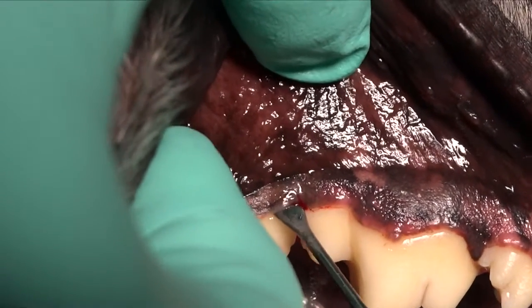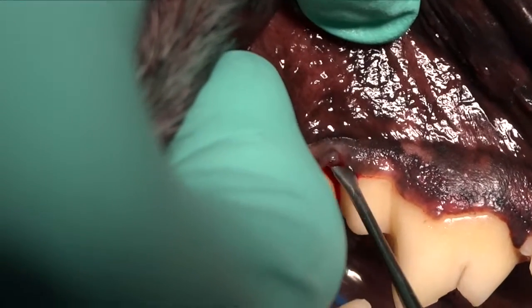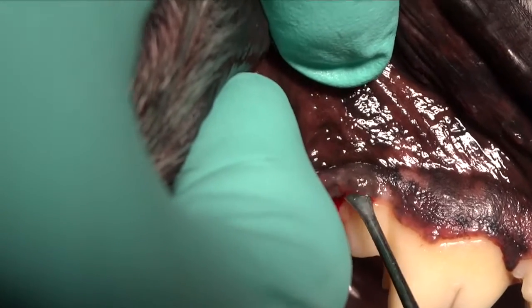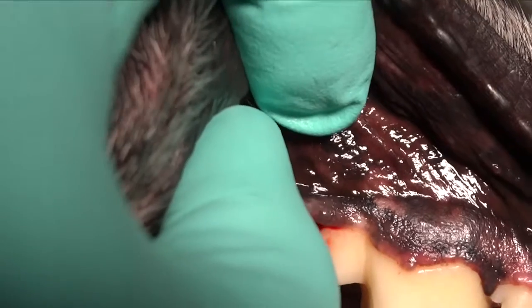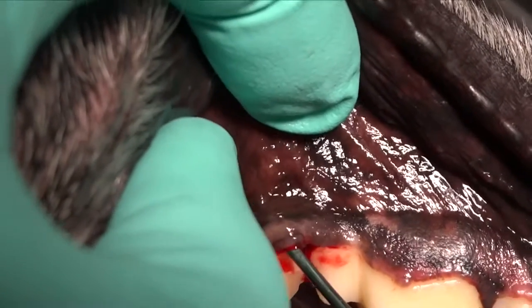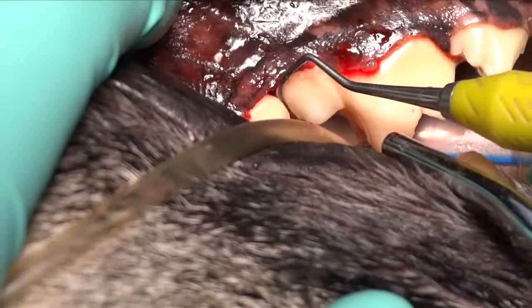These defects are very common back between the first and second molar in the mandible in the dog, so we need to look carefully back there even in young dogs. This dog is four years old. We're using a periosteal elevator to expose that area and then a periodontal curette to remove that granulation tissue.